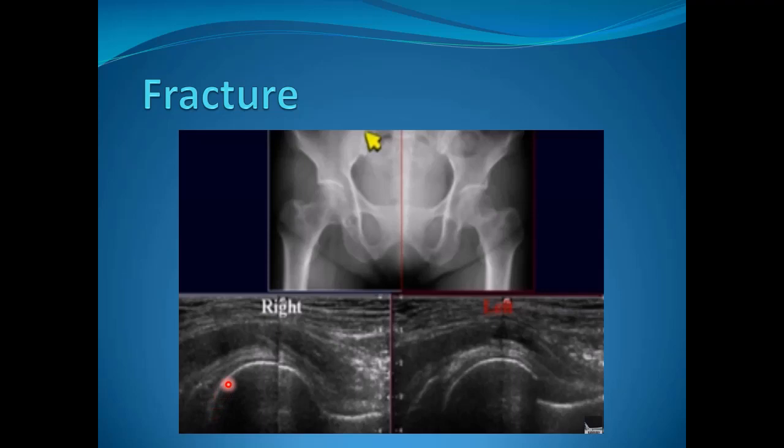Fractures can also be seen by ultrasound. On the right side, we see the normal appearance of the head and neck, while on the left side there is a clear defect in the cortex denoting a fracture. On X-ray, we can confirm a transcervical fracture.